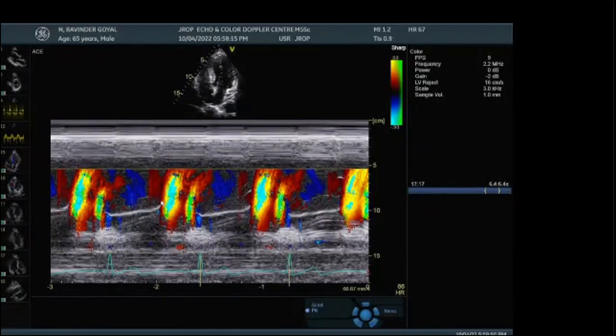Okay, Hiru? Sir, yes, sir. Another thing: in some echo machines, we see an eye scan image. I'm sorry, Hiru, I don't know what eye scan images are. Sir, in our NICVD Institute, Dhaka, all our machines have an eye scan image button. What is the role of this button? Hiru, I'll get back to you.